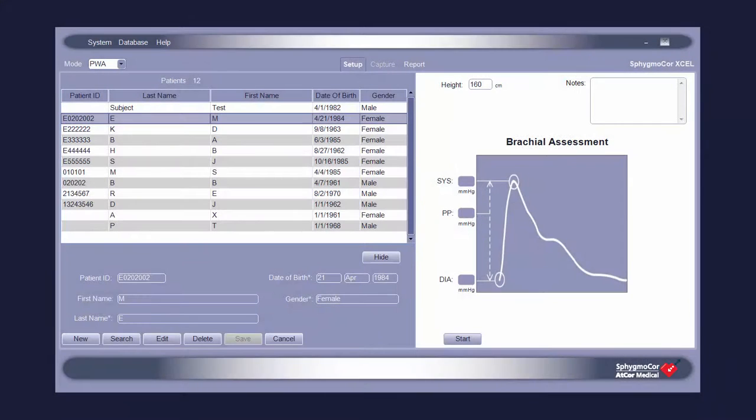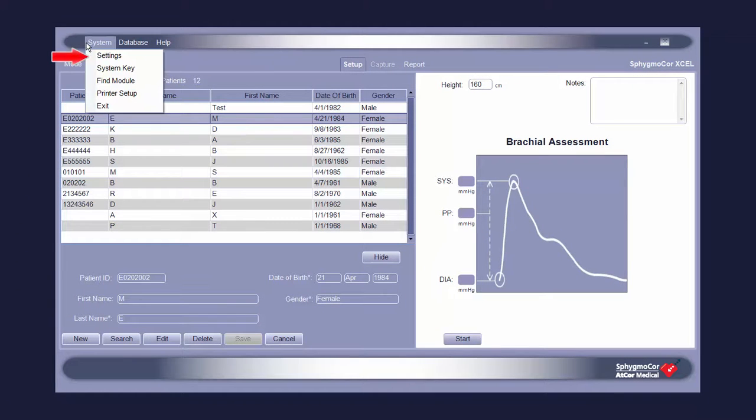To navigate to the Settings window, click System in the upper left of the screen and choose Settings.